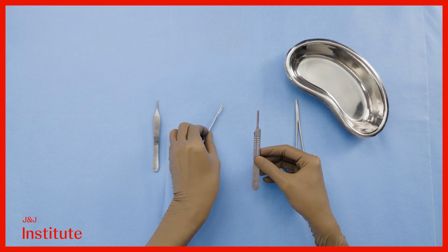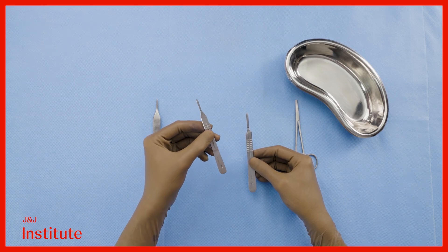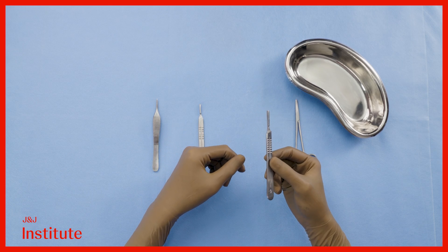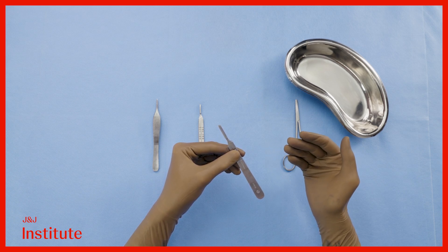The number 3 handle accommodates blades in the 10 series, which includes blade numbers 10, 11, 12, 13 and so forth. The number 4 BP handle accommodates blades in the 20 series, including 20, 21, 22, 23 and so forth.